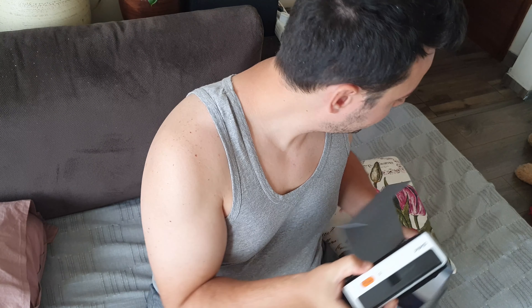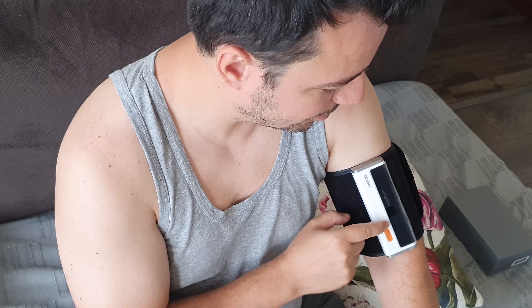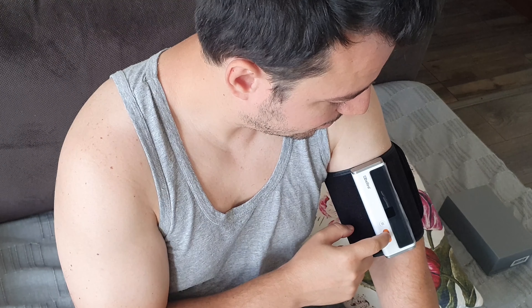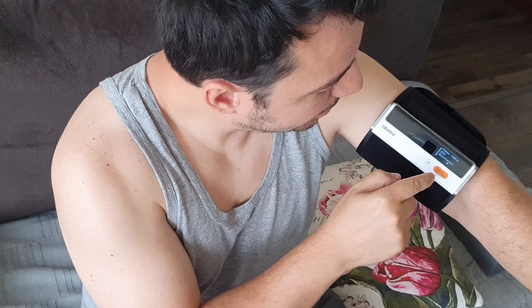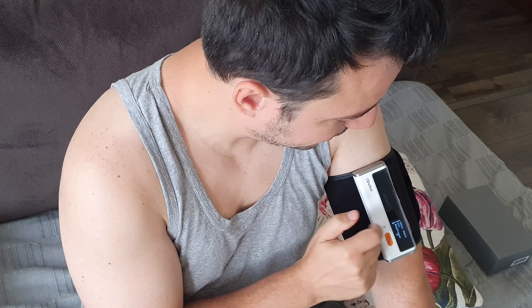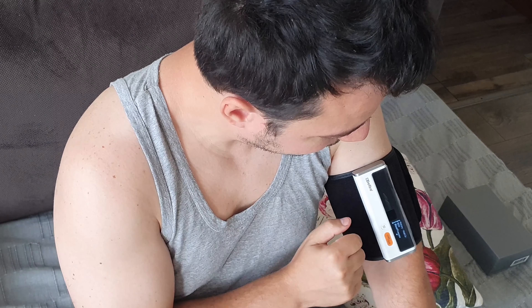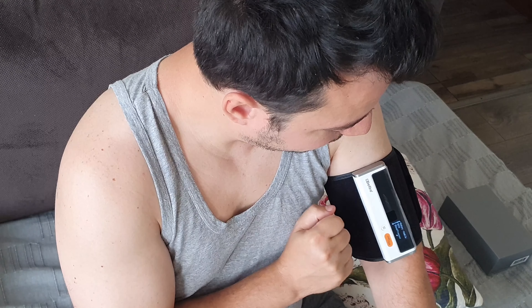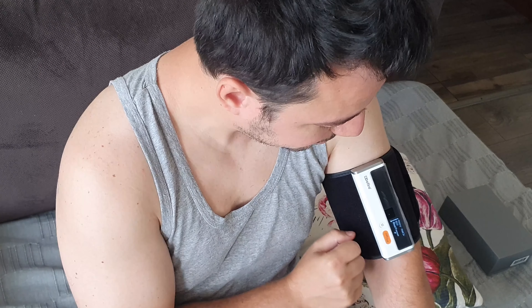A couple of things about this device: the start and stop is the same button, so don't try to press it on the right or left side — it's one button. I also noticed there are arrows on the device. The blood pressure arrow points to the start/stop button. For history, press and hold this button for two seconds. For ECG, you press the other button. So if you want a blood pressure test, press the start/stop button — it's a bit confusing because there's a separator between them.